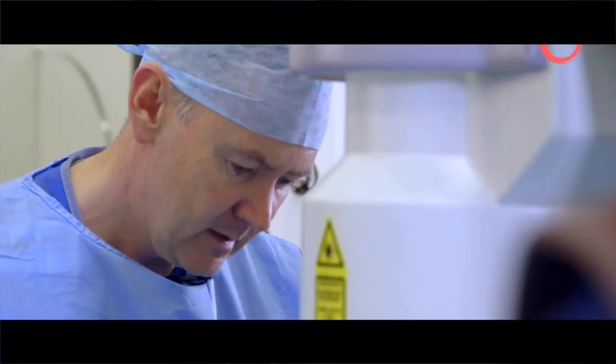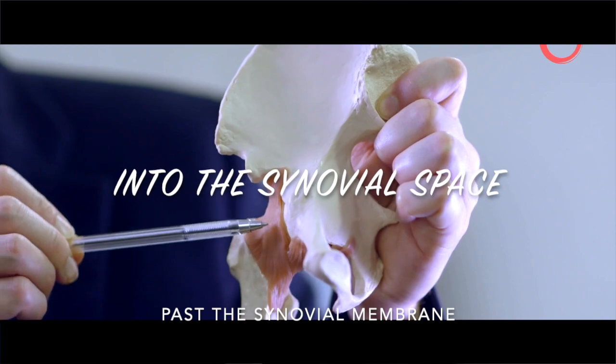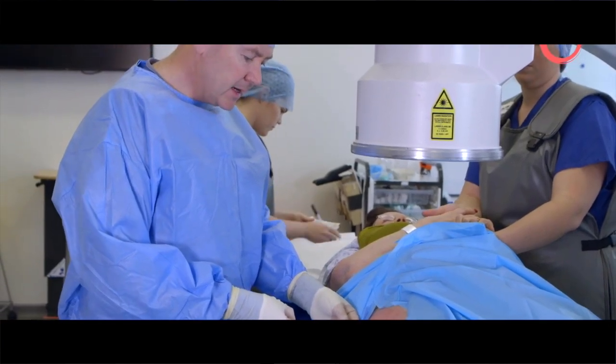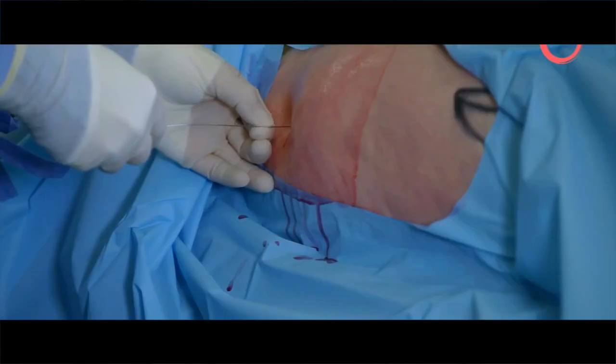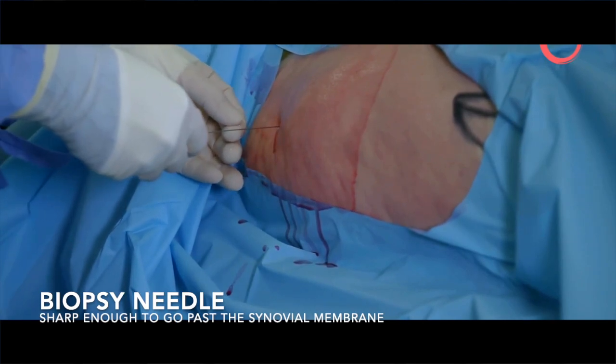So in order to perform a hip joint injection, we want to get the needle right into the actual joint itself, and we want to prove that it's in the hip joint. So I'm just popping the needle in, and we're going to watch where it goes on the X-ray. Flash there, please. We're using the X-ray machine to identify exactly where the hip joint is.